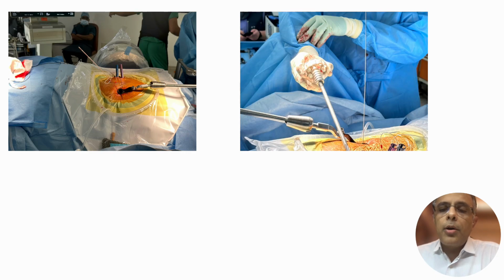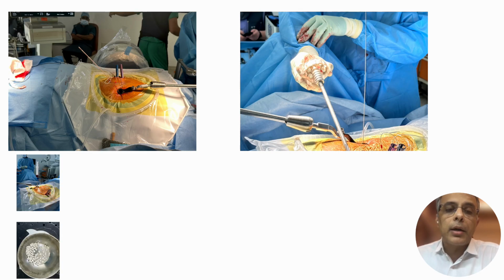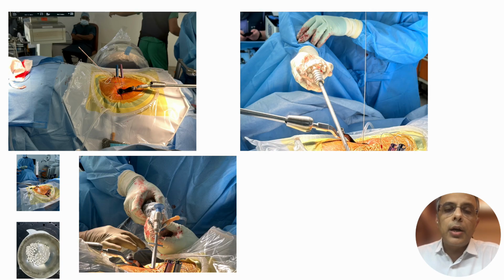Now these are the foraminoplasty reamers which I use sometimes to open the foramen, so that this reamer will drill the SAP, and that will widen the Trans-Kambin zone, and you can even insert a 13 mm, 14 mm cage, which I have done in my practice. Now this is the marrow which I have taken out from the iliac crest, and this is the tricalcium phosphate. We'll mix it and insert it into the cage.